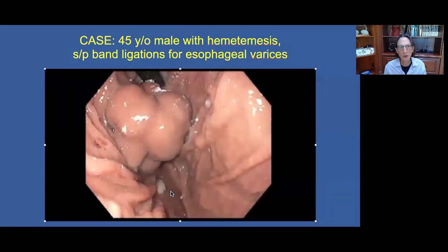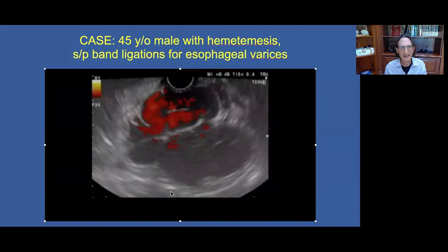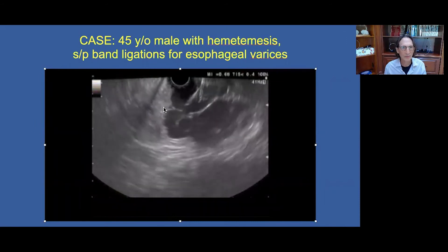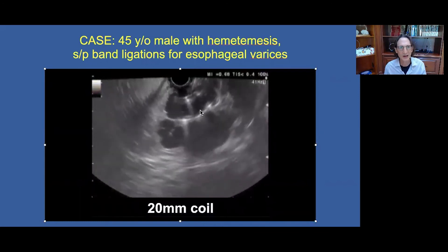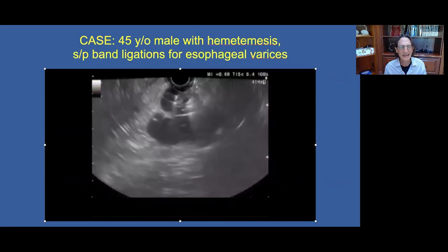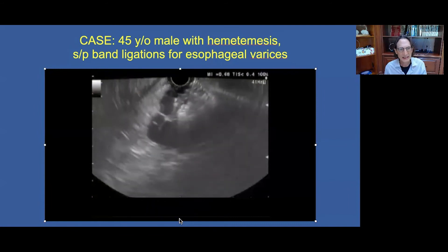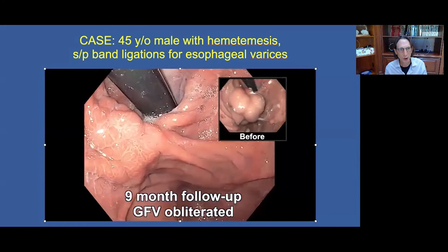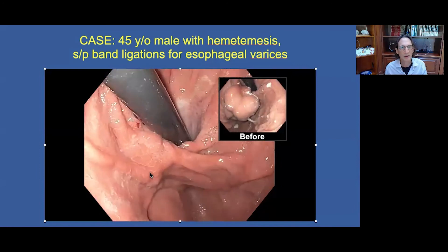This video shows an example of a very large IGV-1 fundal varix. Doppler flow shows active flow. We puncture the varix with a 19-gauge needle and deploy the coil — you can see it unraveling inside the varix; it's very echogenic, a large coil at 20 millimeters in diameter. We then follow with two milliliters of cyanoacrylate glue, specifically the octyl-2 cyanoacrylate, the Dermabond. Nine months later, the gastric fundal varices are obliterated.